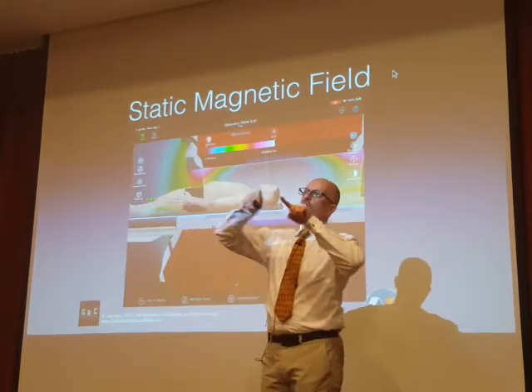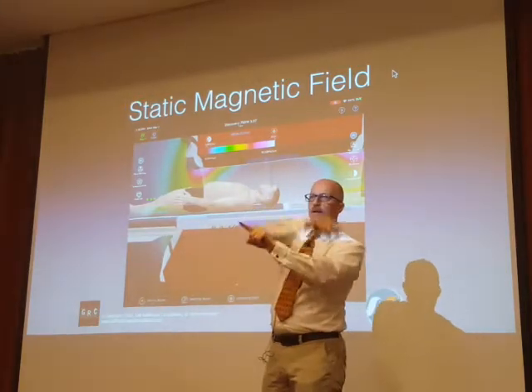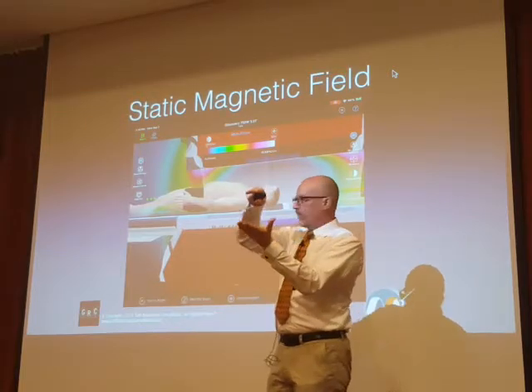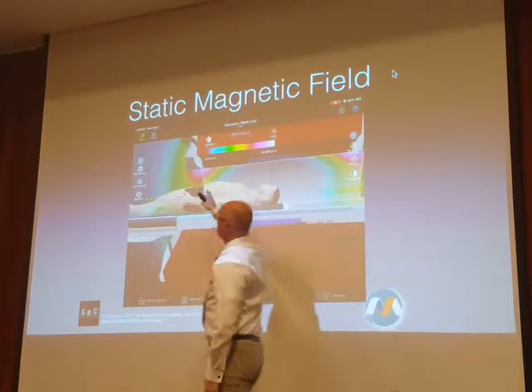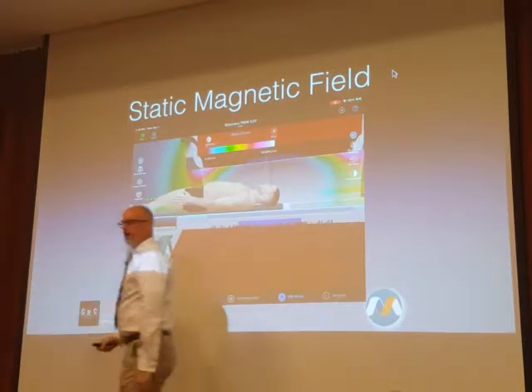Whatever magnet you have, if it's a tube-style bore format magnet, that's the region where the spatial gradient will be greatest. It's also radially symmetrical, which means we're really describing an area around the opening, not just at one point, but that value is consistent around the opening. And then it drops off fairly rapidly as we get away from the opening.